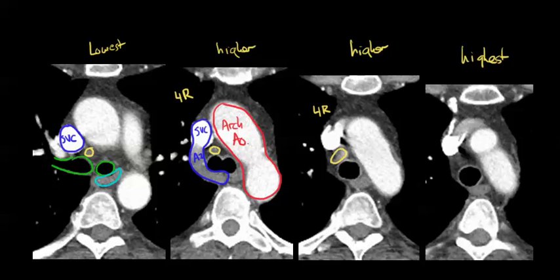The reason this is the highest is because you've got the takeoff of the innominate artery here — so this is your innominate artery, and that is the end of the 4R's. This node right here is going to be your highest 4R. By now we are sitting on the trachea, and the esophagus is still sitting right crammed in this corner.